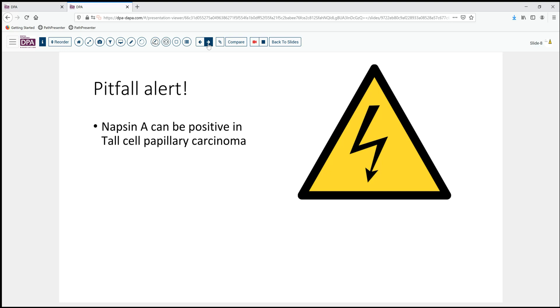It is not typical for us to need immunohistochemistry. But if for some reason we begin to question whether or not a nodal lesion is metastatic lung cancer, and we do a Napsin A — well, tall cell carcinoma is going to be positive with Napsin A and TTF1, and therefore can easily masquerade in the wrong setting as potentially metastatic lung cancer rather than the tall cell papillary carcinoma variant.